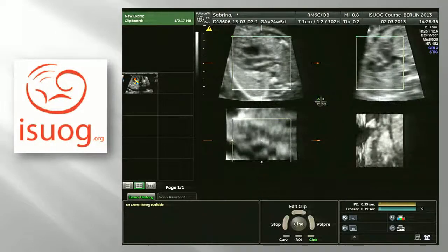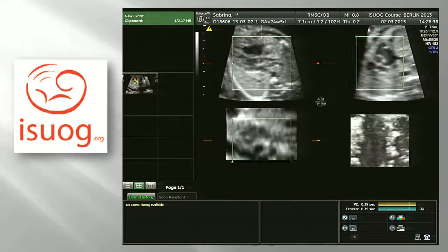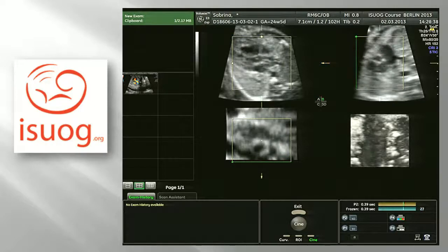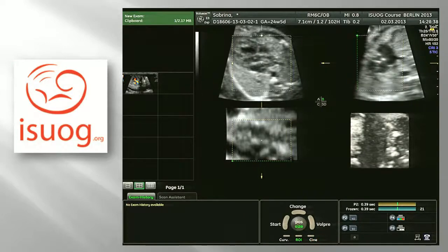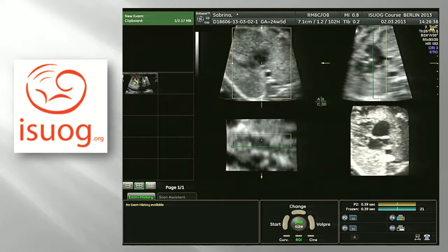And at the end, I choose for a rendered image. I always go to plane B. I decrease the size of the box, change it so that I have a background in my box. I always like to have sepia and blue.